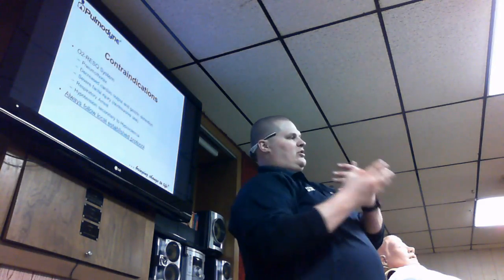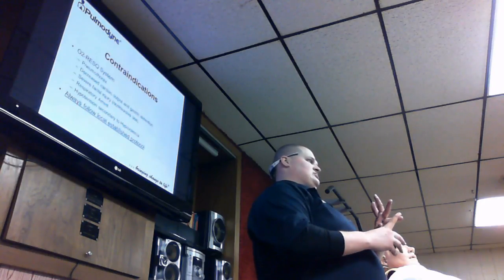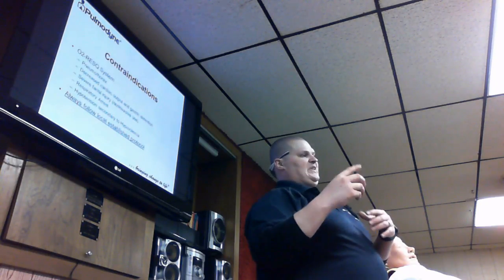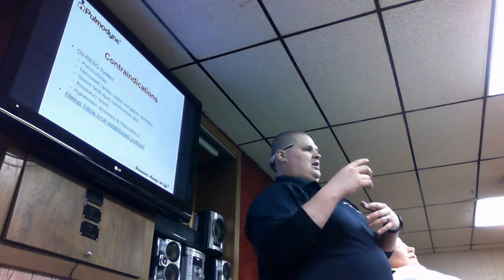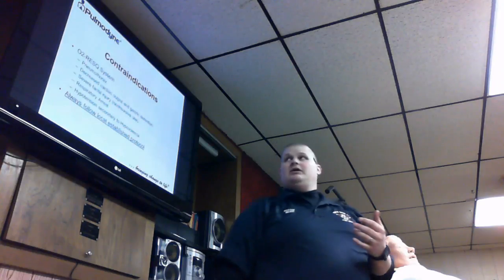So in order for this to work properly, I've got to have a heart that's perfusing and a blood pressure. So that means a blood pressure over 90 systolic. In order for me to get proper exchange into the blood, I've got to make sure that blood's pumping. Okay.